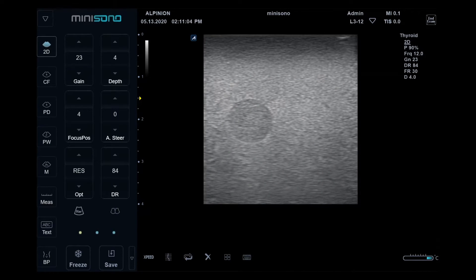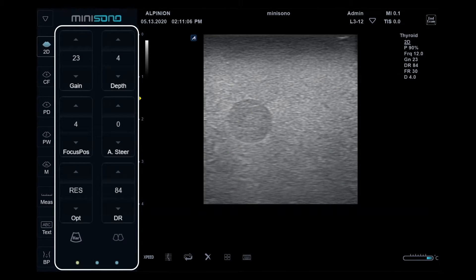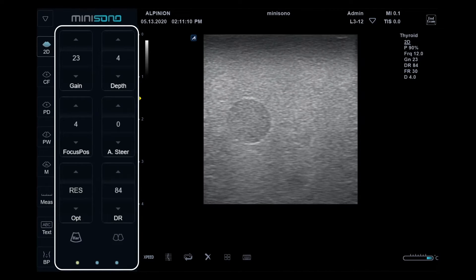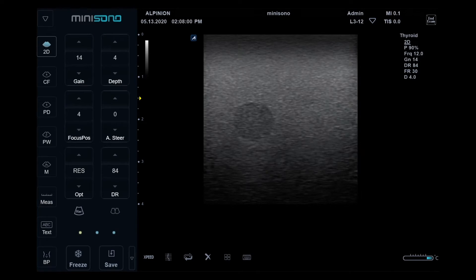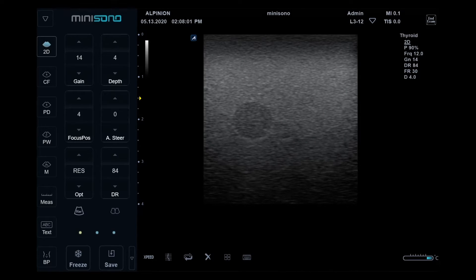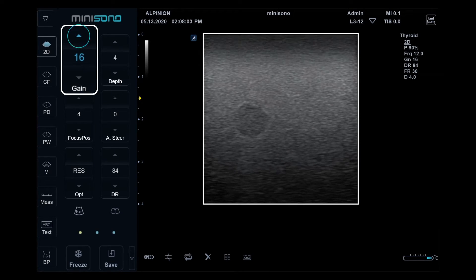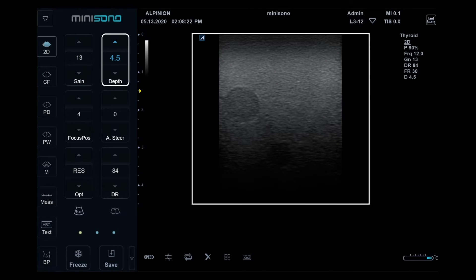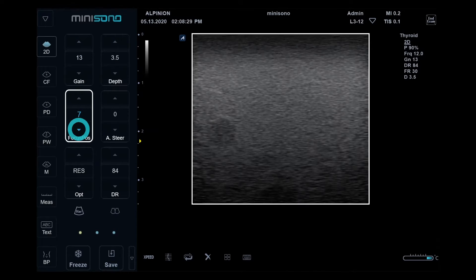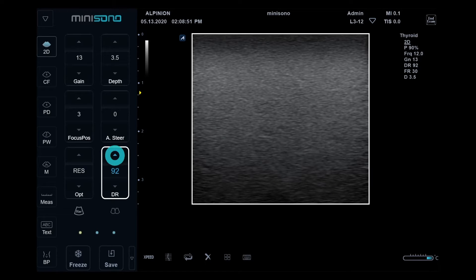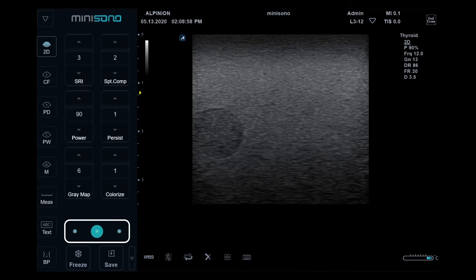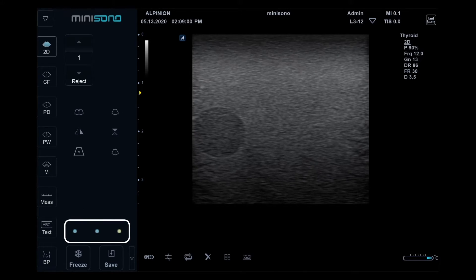On the control area, you can select imaging mode and adjust image parameters. For example, to change the gain, tap the arrow or swipe. Depth, Focus, and DR are changeable in the same way. If you tap or swipe the page indicator, you will find more parameters.